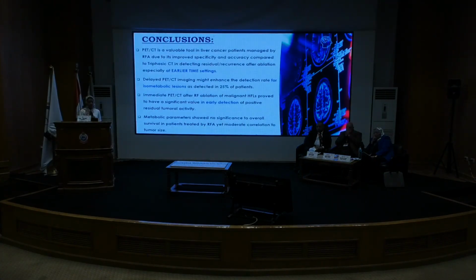When it comes to the conclusions, PET-CT provided improved specificity and accuracy compared to triphasic CT in detecting residual or recurrence after ablation, especially at earlier time settings. Delayed PET-CT imaging might enhance the detection rate for isometabolic lesions, as detected in 25% of the patients in our study. Immediate PET-CT after RFA of malignant hepatic focal lesions proved to have significant value in early detection of positive residual tumoral activity. And finally, only the baseline tumor size showed significance to overall survival, unlike the metabolic parameters.